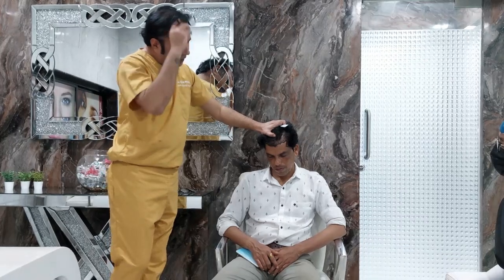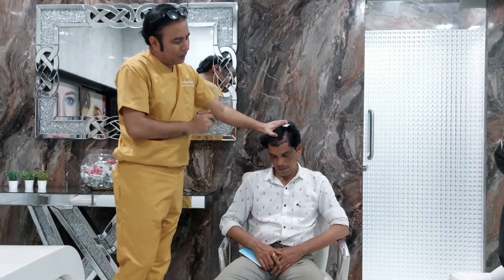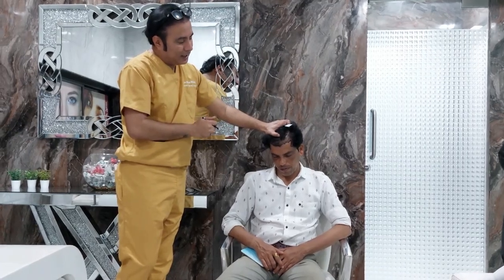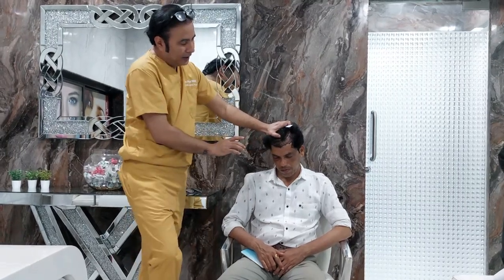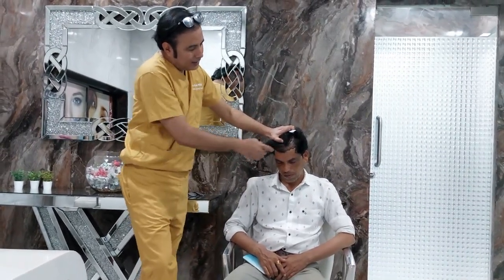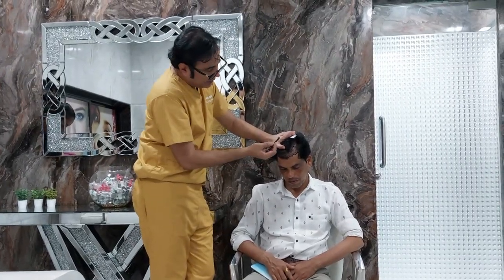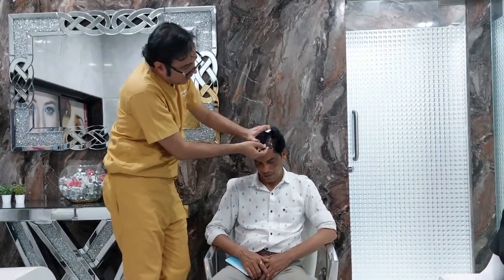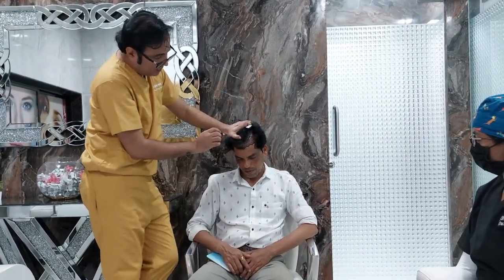There are various pitfalls which we will talk about when we are talking about hairline designing. The first thing is never make it flat. You have to create irregularities. Second thing is the direction. When we are putting the follicles in FUE technique, we will be taking them from the donor and putting them here. So the direction and the angle is something which is very important.